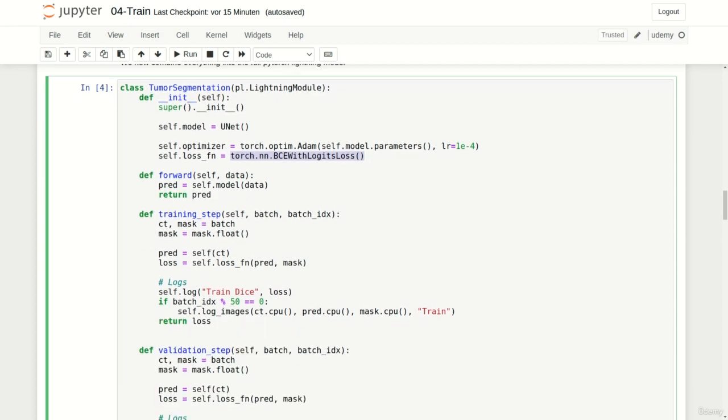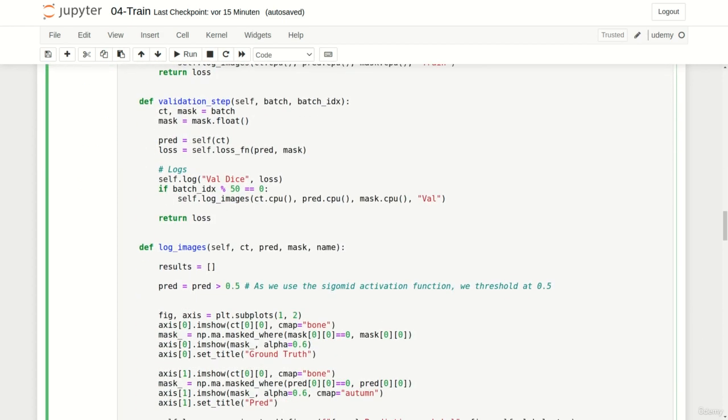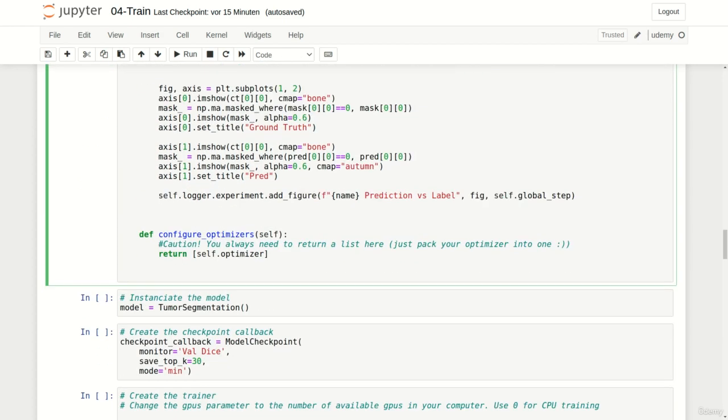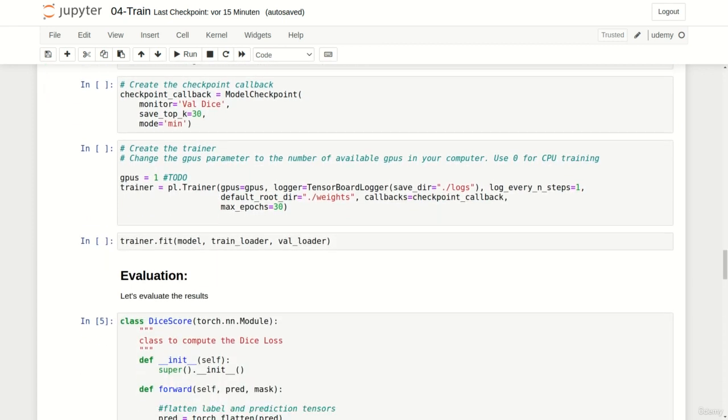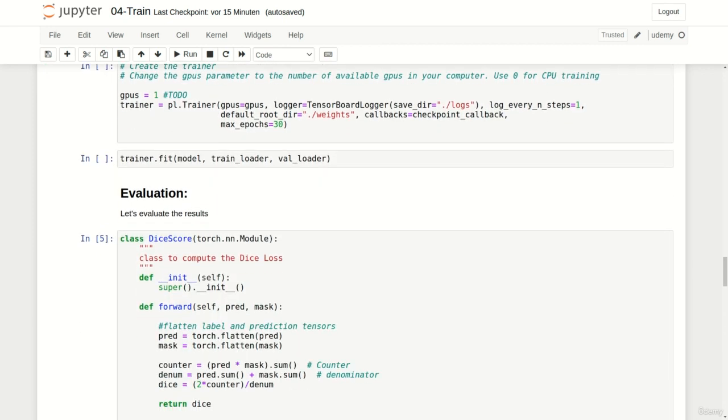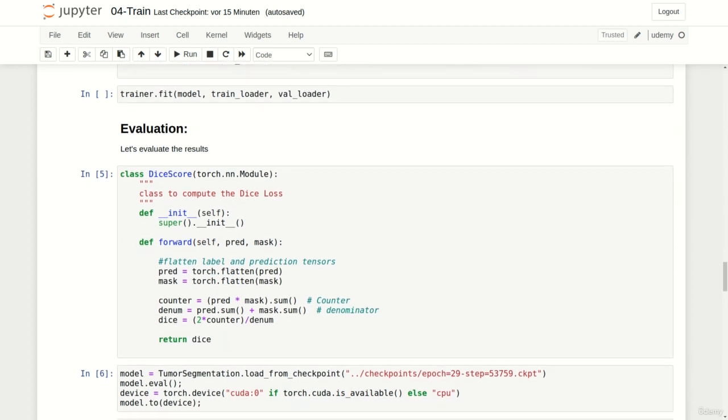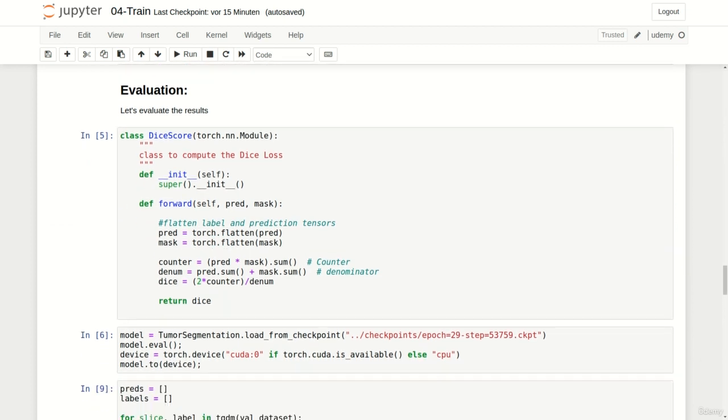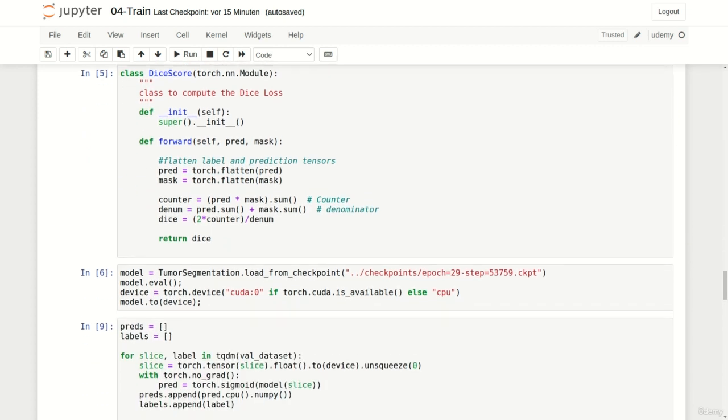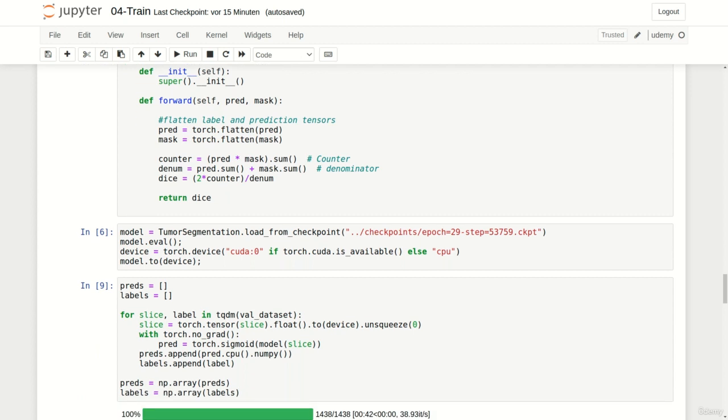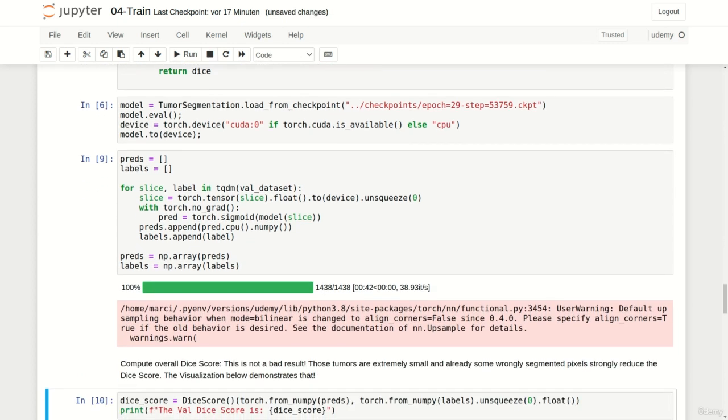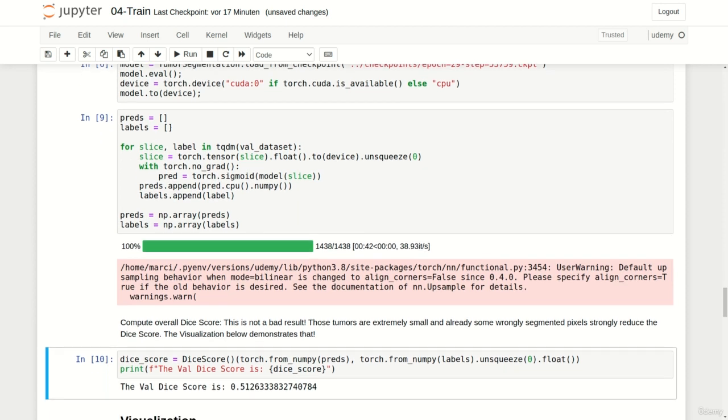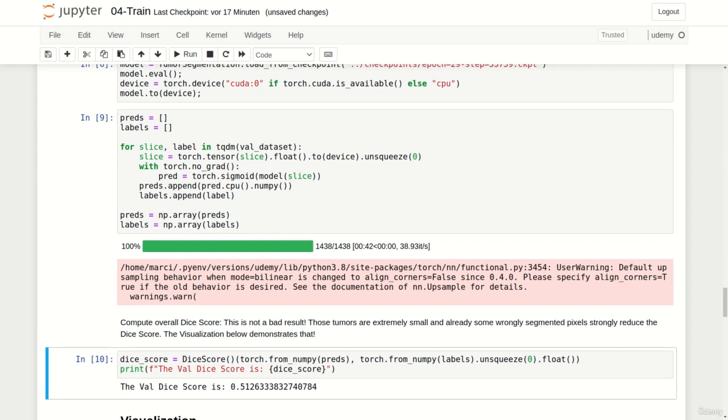Let's now have a look at the final evaluation. I took the dice score implementation of the last lecture and simply removed the one minus statement. This function now calculates the dice score. When evaluating the complete validation dataset it yields a dice score of 0.51.